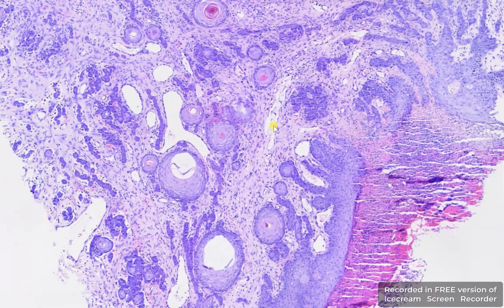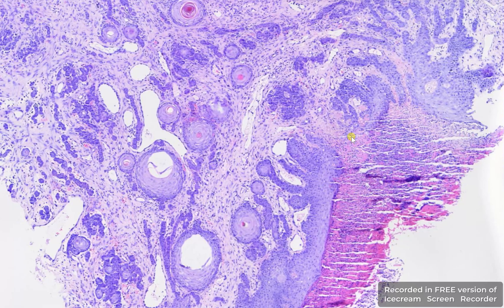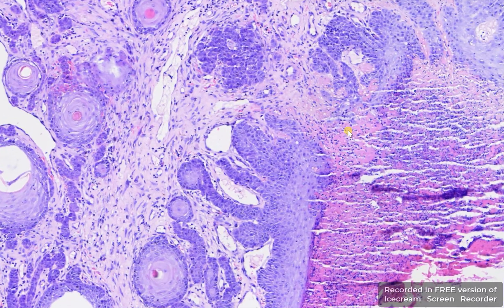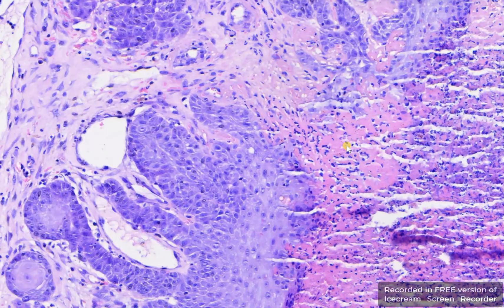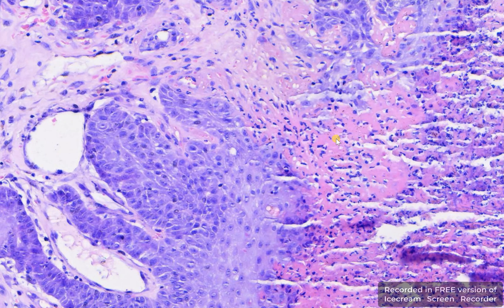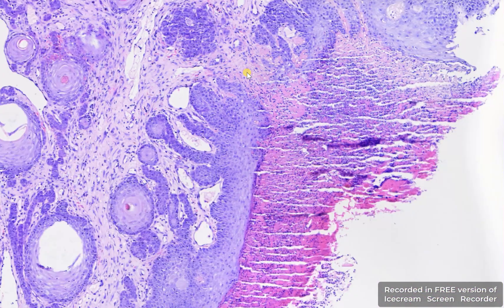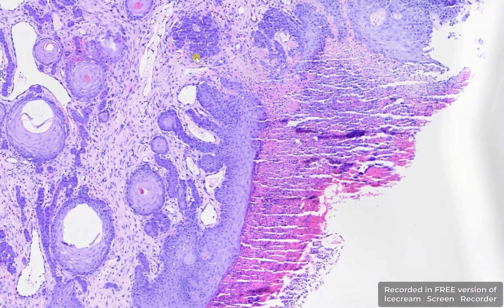This dog also had an ulceration. You can see a lot of viable and degenerated neutrophils with an exudate, and the destruction of the basement membrane here, which is what we call ulceration.